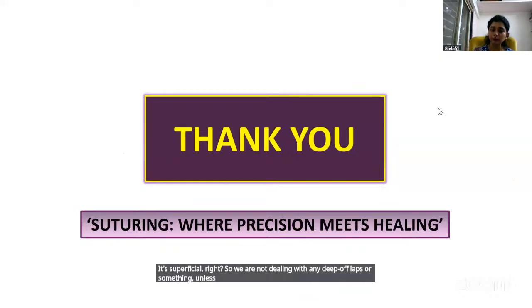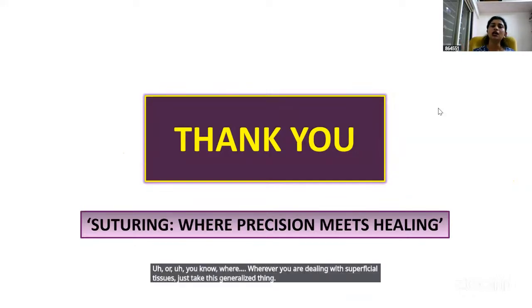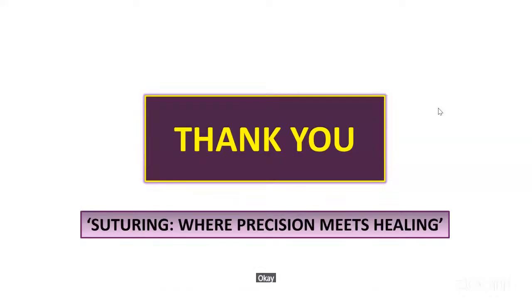Wherever you are dealing with superficial tissues, just take this generalized rule: we will make use of a 3/8 needle because it is a very shallow needle. So we use it for superficial cases. You can definitely use it for extraction sockets, but the half-circle needle is very commonly used for extraction sockets.